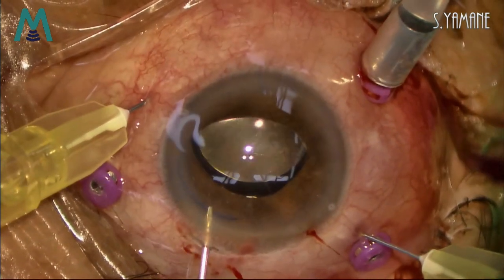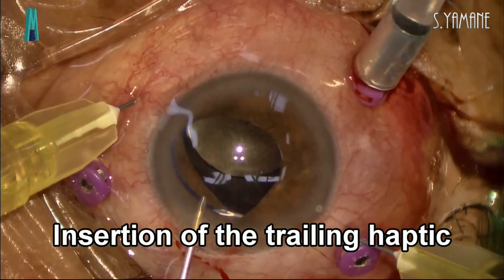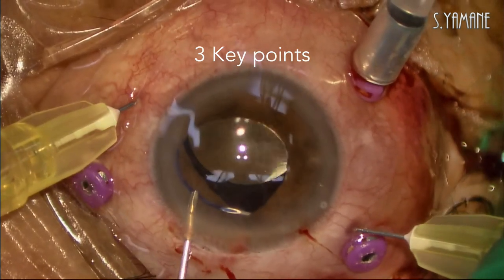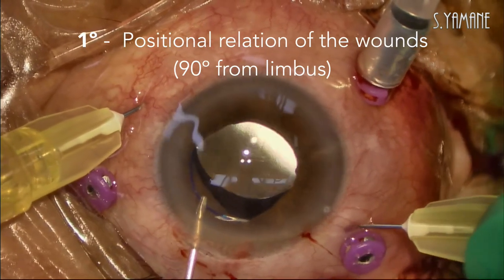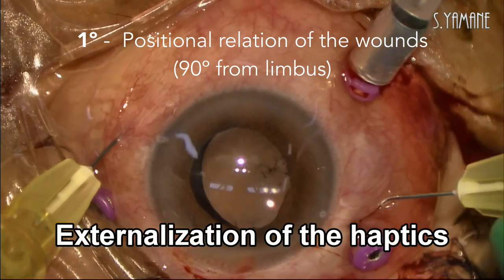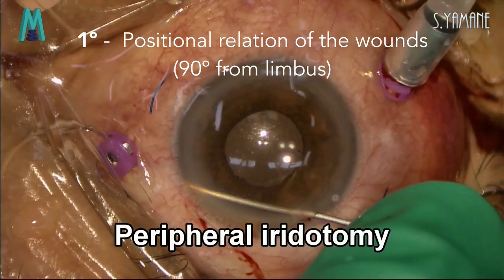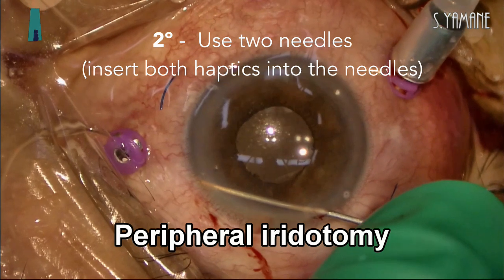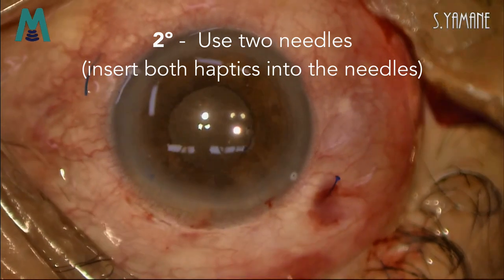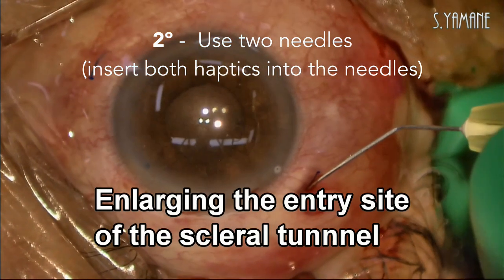In fact there is a learning curve, but I think many retinal surgeons can do this surgery. The technique has three key points. The most important thing is the positional relationship of the wounds. The wounds for IOL insertion and needle insertion at approximately 90 degrees is appropriate. The second point is to use two needles. The leading haptic keeps inside the first needle during trailing haptic insertion to the second needle.